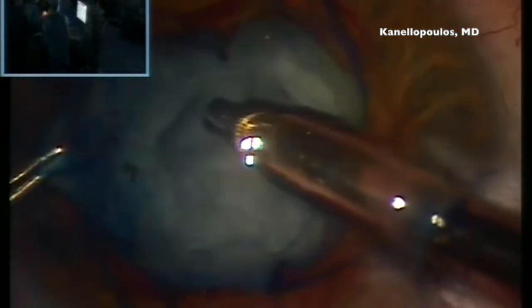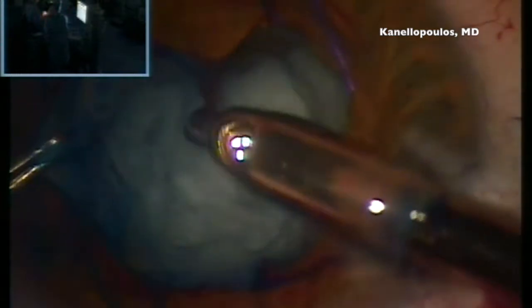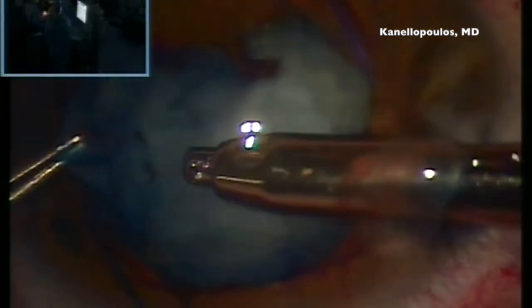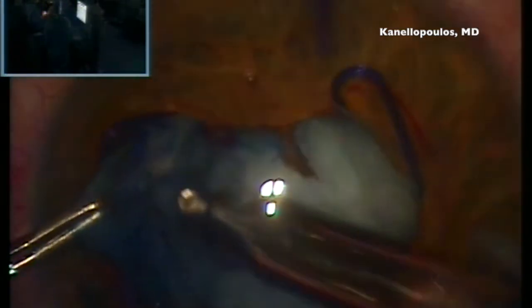I'm pulling back here the capsule opening that I've created, the flap, and you see how with just aspiration I'm able to pull out a lot of this denuded lens material, crystalline lens material.